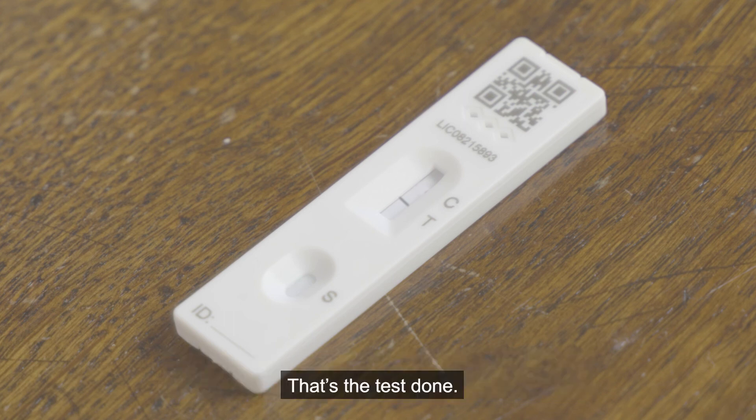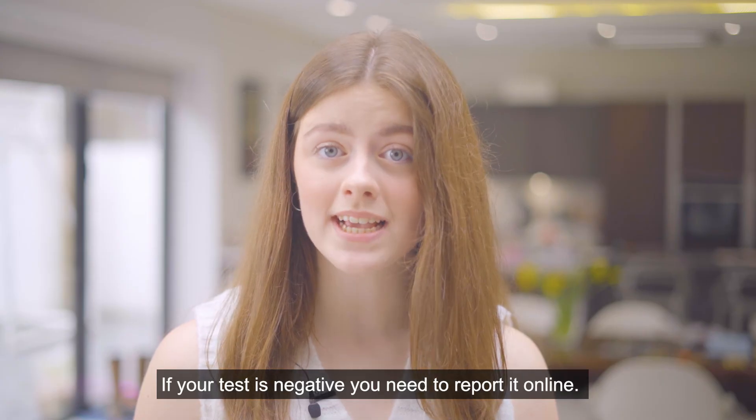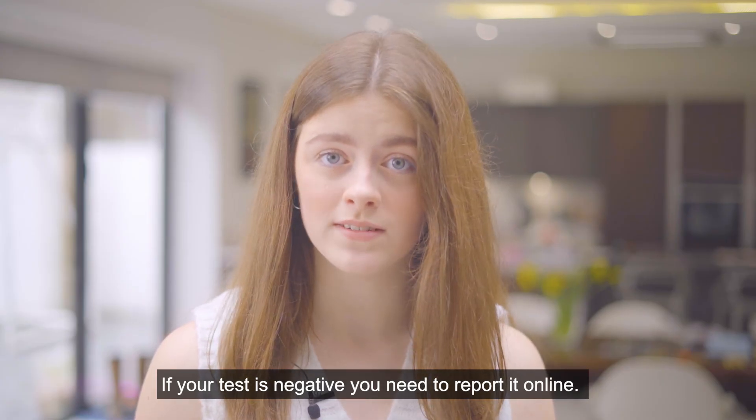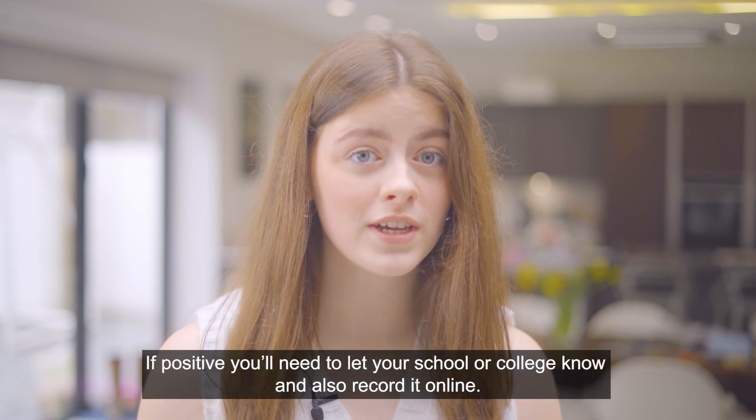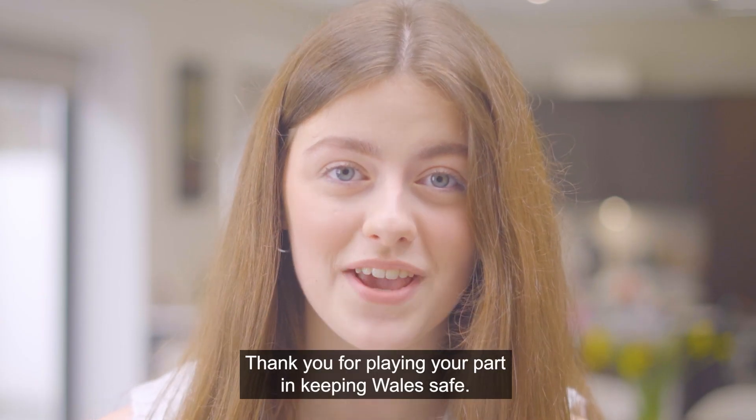That's the test done. Important next steps: if your test is negative, you need to report it online. If positive, you'll need to let your school or college know and also record it online. Thank you for playing your part in keeping Wales safe.